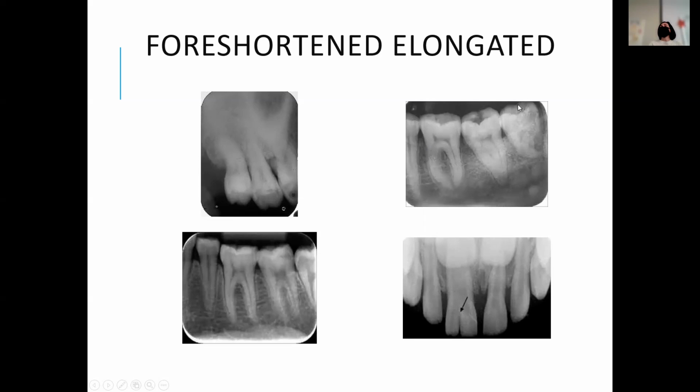Now this does have a shorter root in general, just because it's a wisdom tooth. So there is some of that, like this root ends here, but you can just see that there's more occlusal. To me, that's the big key, there's a little bit more occlusal surface showing. So it wasn't taken straight on, like perpendicular. And then this one, this is an occlusal image taken on a kid, because you can see their permanent central incisors up here that are starting to come down.